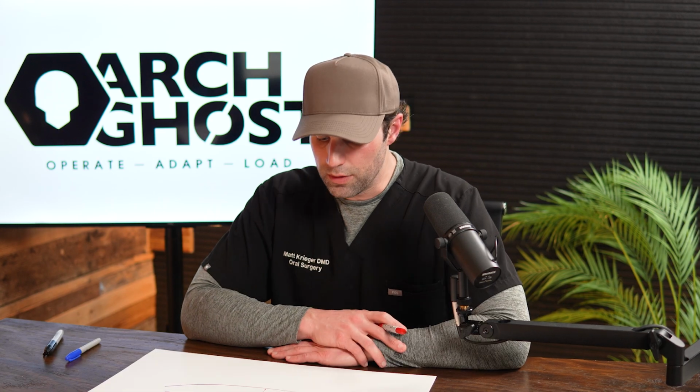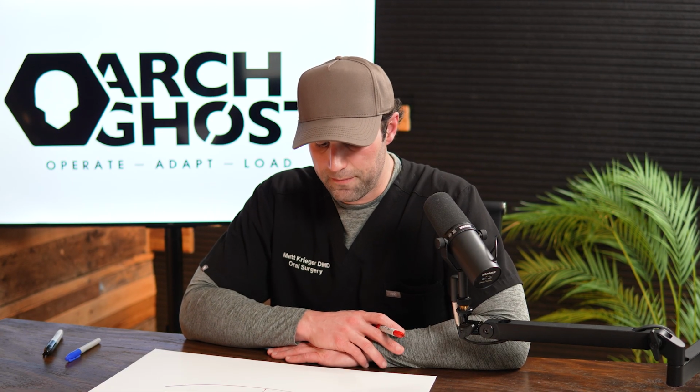Now, I will say that a key to doing this is that you use what I call the low RPM osteotomy technique. And you can find that on my website. It's a blog article. But the very short summary of that is you need to drill these osteotomies slowly to ensure that you can feel if you are popping into the sinus. And you can confirm your anatomical location by the feel of your drill.